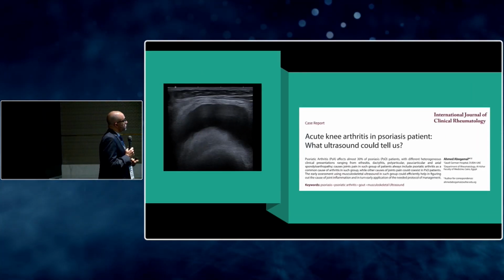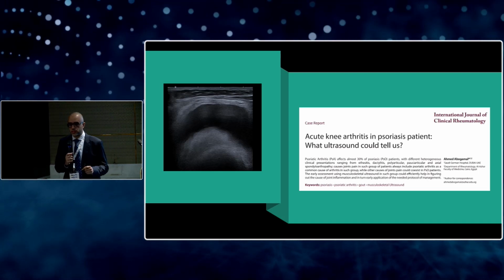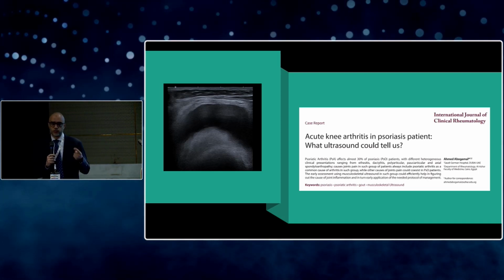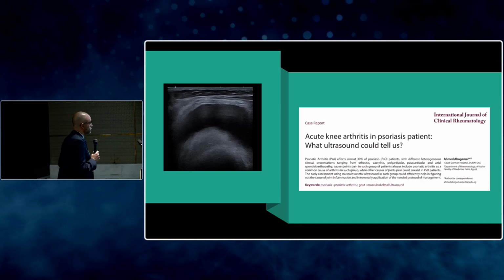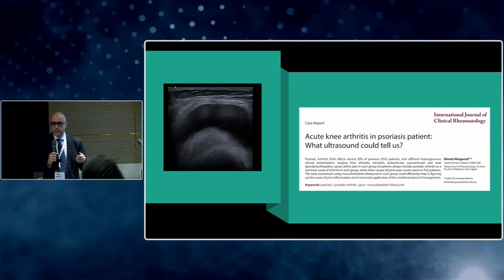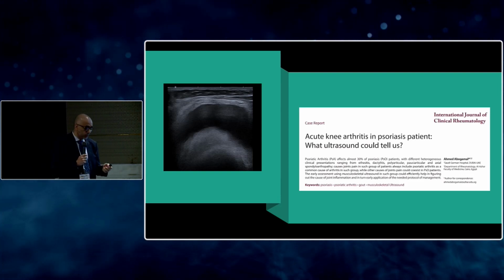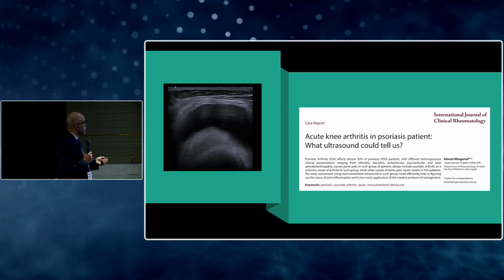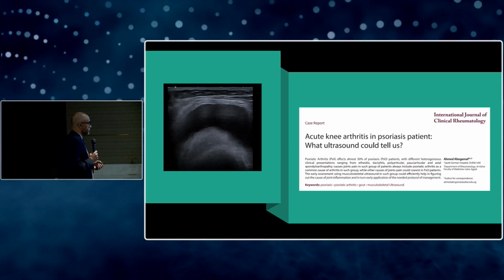Fourth story is about Peter. He's one of my patients, a really known patient with psoriatic arthritis. He was controlled under Cosentyx for many years, coming every 3 months to take his medications, with a very good response. One time he arrived at my clinic with an urgent appointment, coming in a wheelchair with one knee extremely swollen with dense effusion. This is a highly extensive effusion covering the suprapatellar recess.